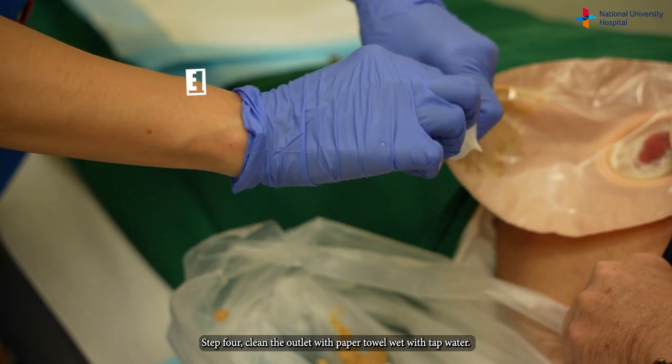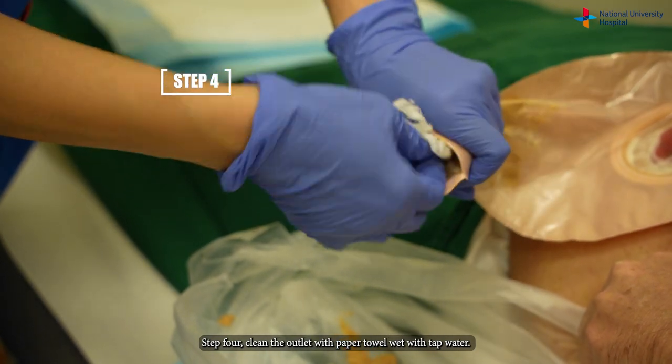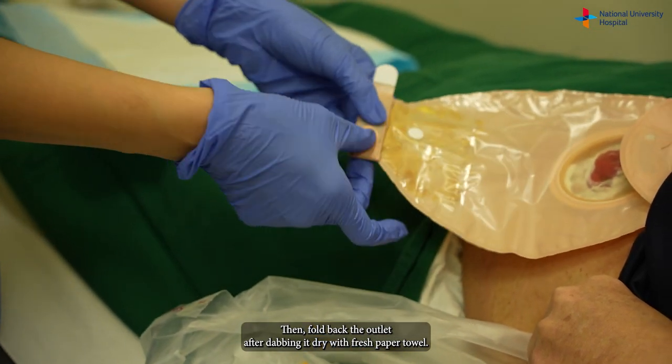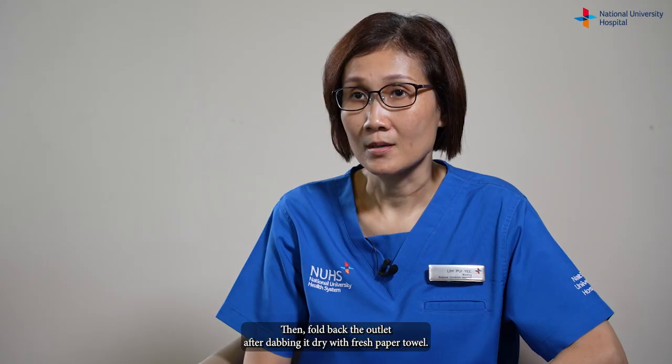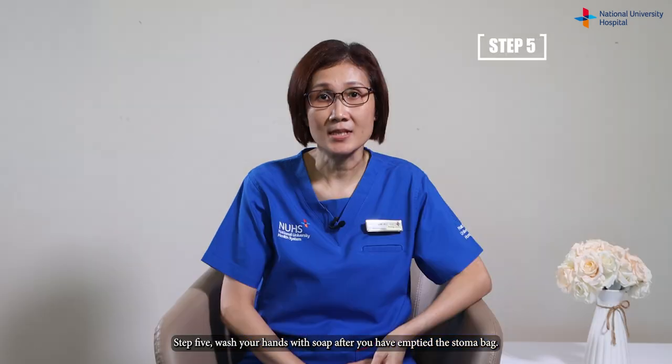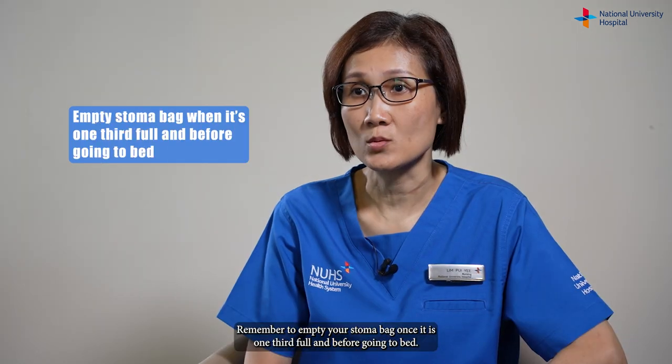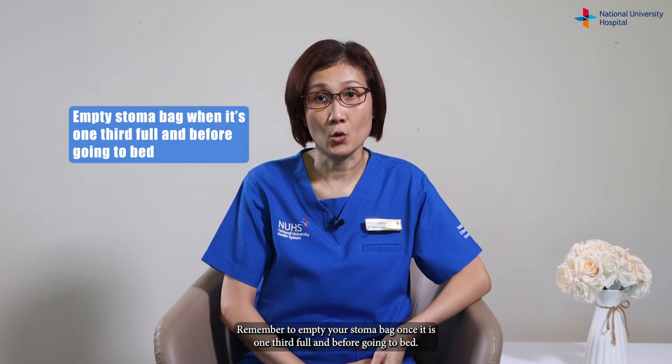Step four: clean the outlet with paper towel wet with tap water, then fold back the outlet after dabbing it dry with a fresh paper towel. Step five: wash your hands with soap after you have emptied the stoma bag. Remember to empty your stoma bag once it is one-third full and before going to bed.